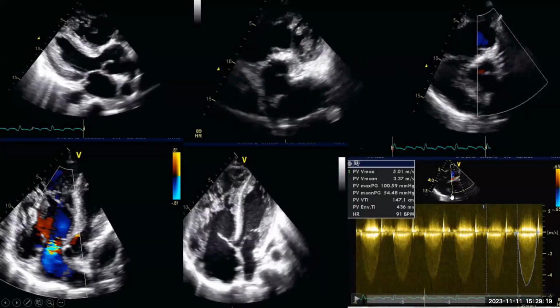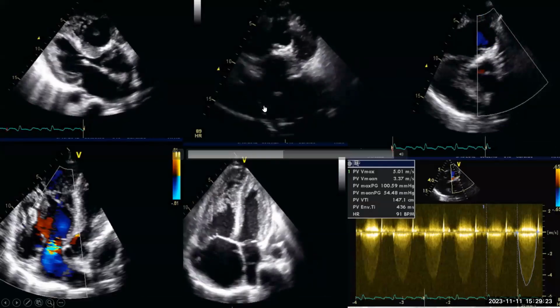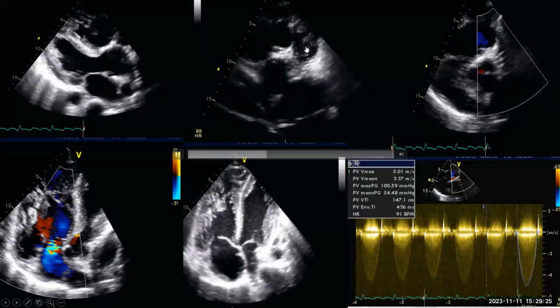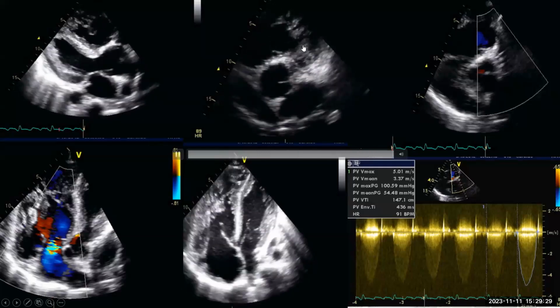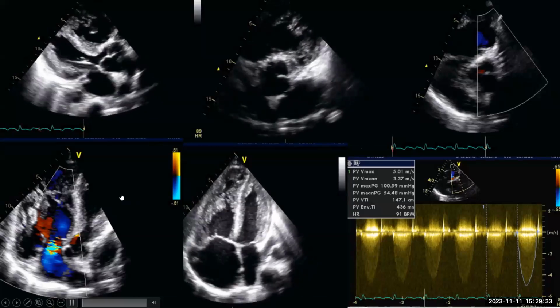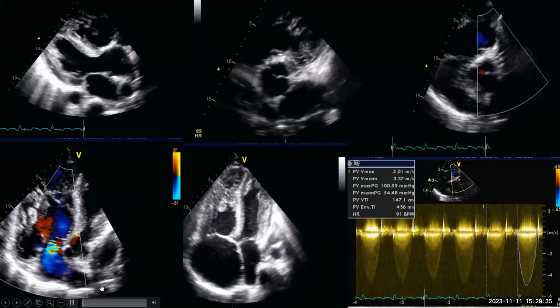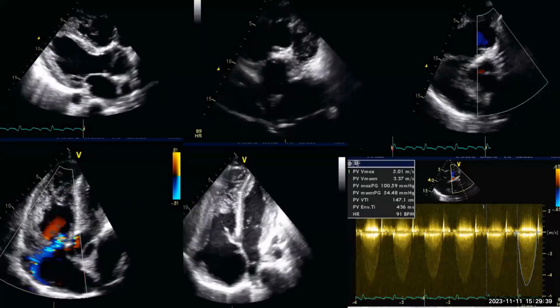So now, the cause of severe pulmonary stenosis here is subvalvular, as you see here. Heavy trabeculation obstructing the RVOT. So RVOT obstruction here. The fourth component is the VSD. I did not bring the view here because it was repaired. However, you may tell sometimes it's trilogy of Fallot.